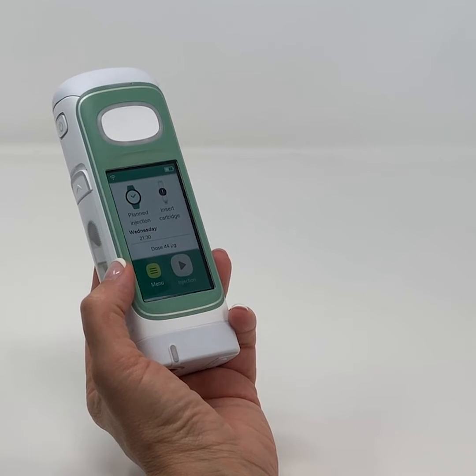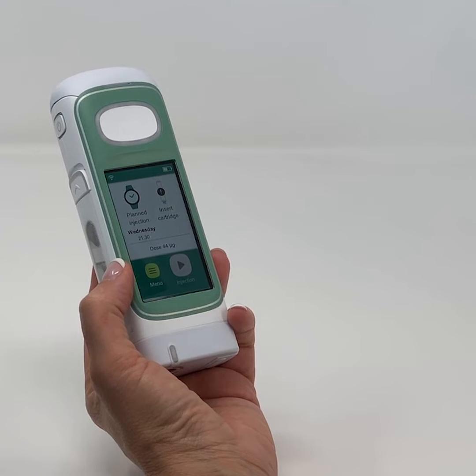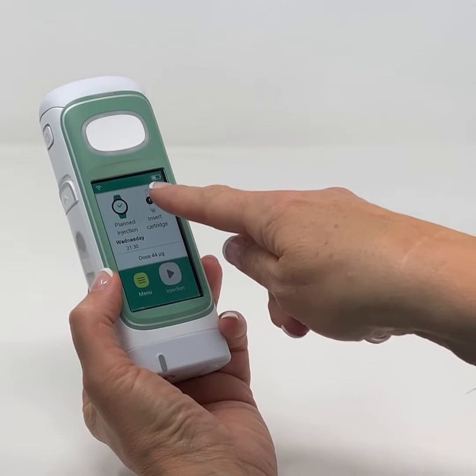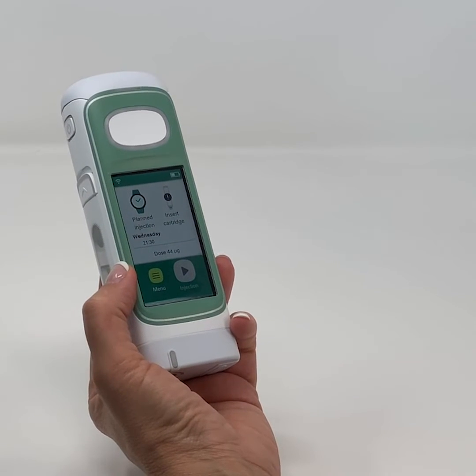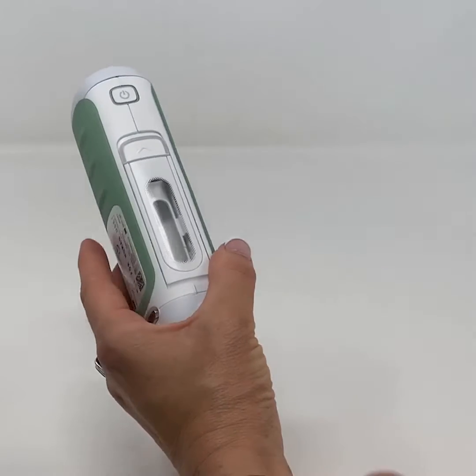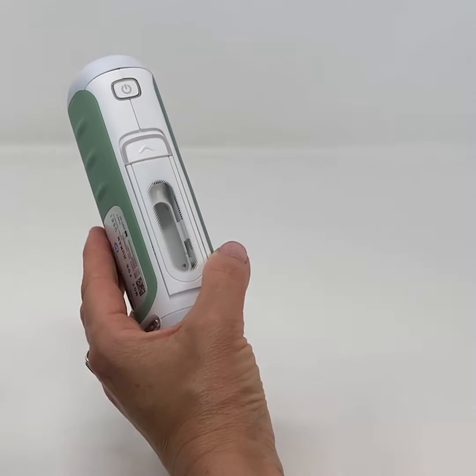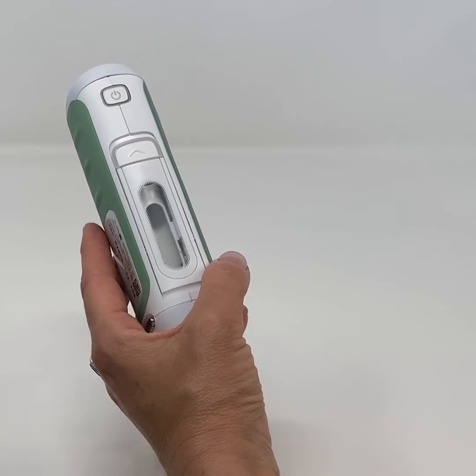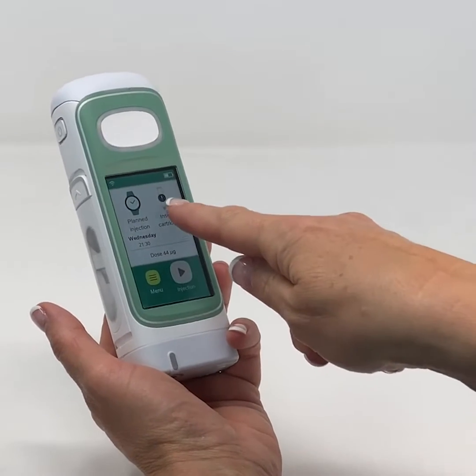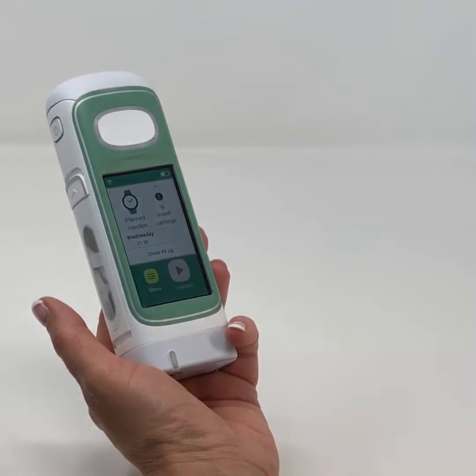When inserting a new cartridge, if there's a cartridge in place, the screen indicates how many doses remain. Each cartridge contains three preset doses. The information screen will inform you whether you need to insert or replace the cartridge. Note that it will only accept a new full cartridge.